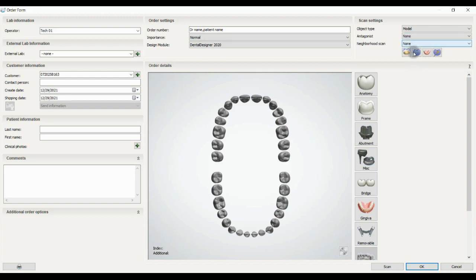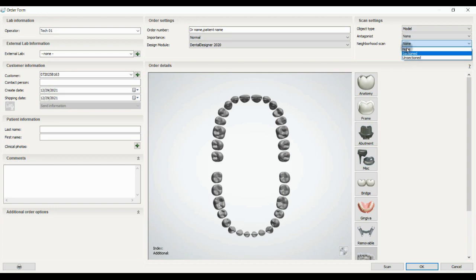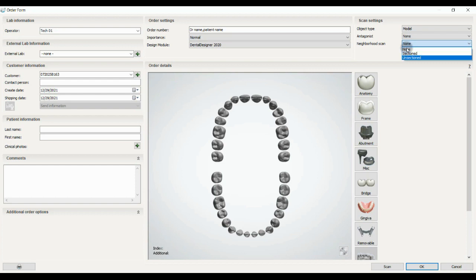The next one is neighborhood scan, where we can choose none or we can choose section cast that you have a die and that's removable die, or unsectioned, which means you have a one-piece cast and you scan it in one piece.